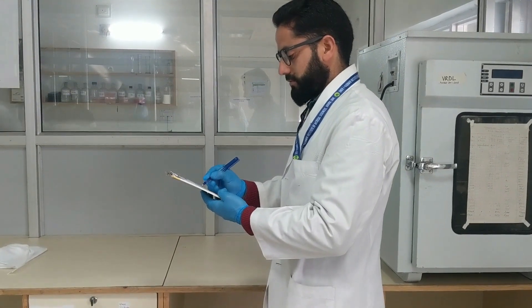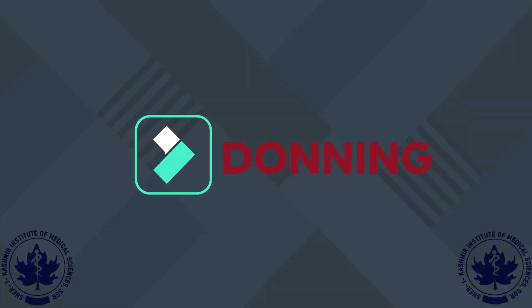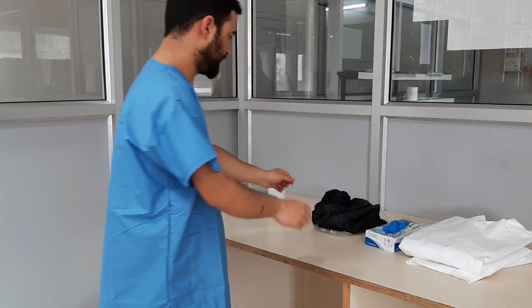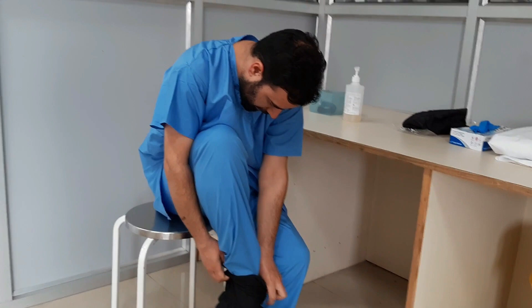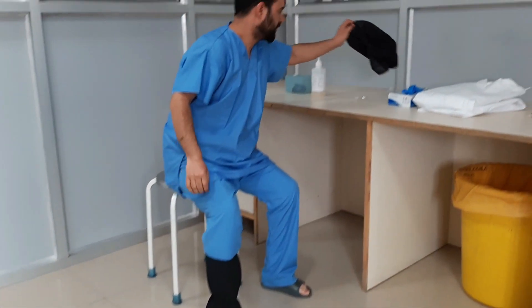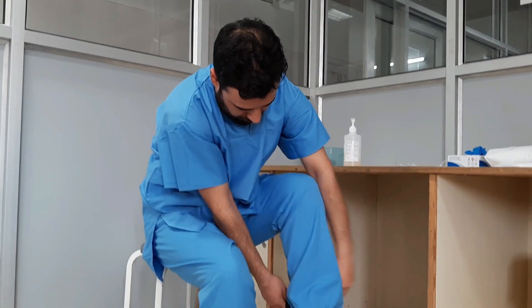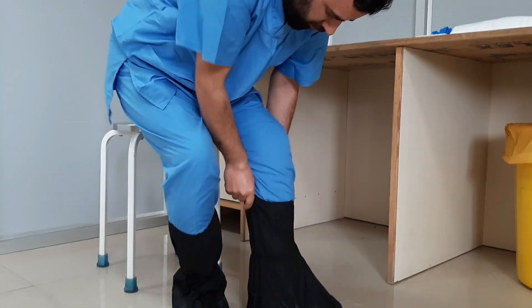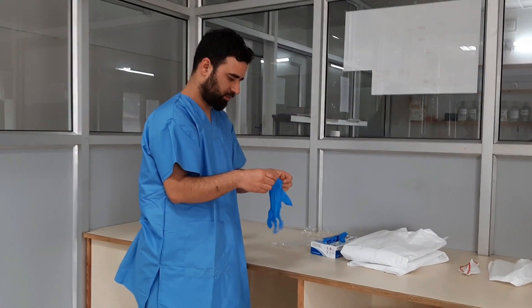A non-biased observer should ensure that the checklist is followed. Sit down and wear appropriate disposable shoe covers or boots as provided in your PPE kit. Wear a pair of non-powdered gloves appropriately.